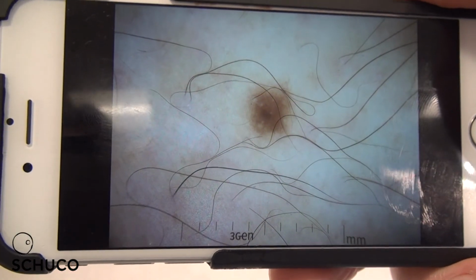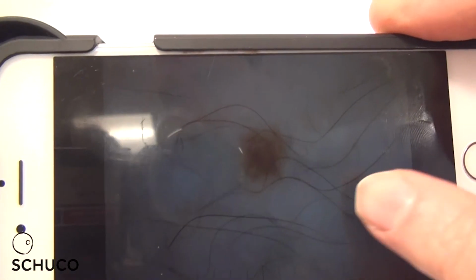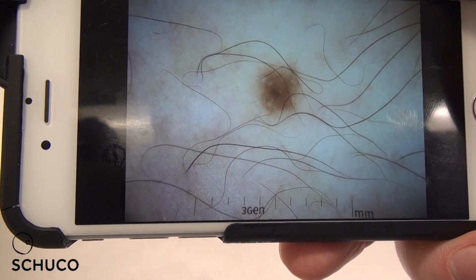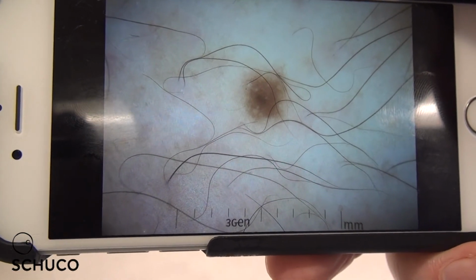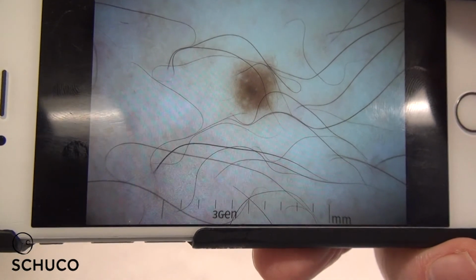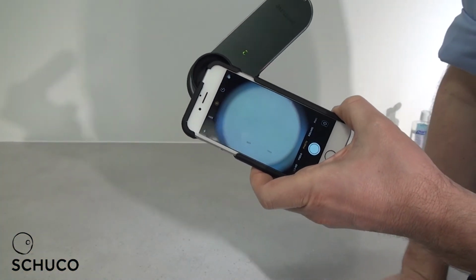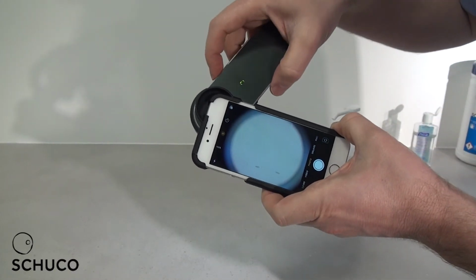This is the image that has been taken. As you can see, the graticule is nicely placed along the long axis. There are a few hairs overlying the mole here, but the mole is in focus, and this would be fine for using in teledermatology.